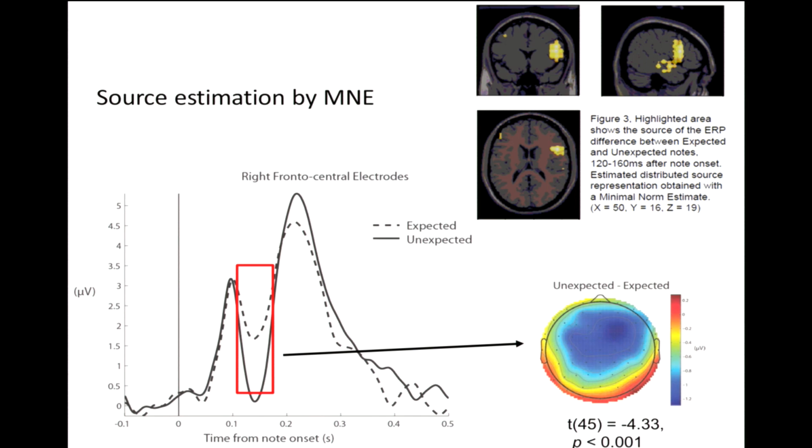It doesn't tell you where exactly. That's natural because we know the functional, the topographical localizations, it's usually broad and it's very difficult to say exactly where in the brain. But if you feed this data into source reconstructions using, I think we use a minimum norm estimate there, we found after doing proper statistical comparisons, the difference is primarily located here.